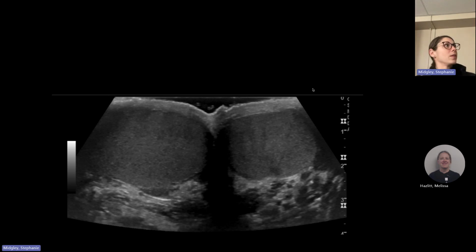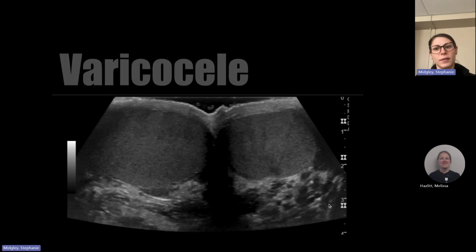This one's a little bit larger testicle. Left. But the left. Reading into it, like the scrotum posterior, the tissue there just doesn't look right. I guess like loss of architecture. There are hypoechoic areas. What would you want to do on the machine to help figure out what this is? You're right, there's something bizarre back here. Probably color.